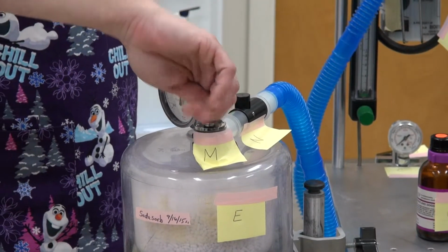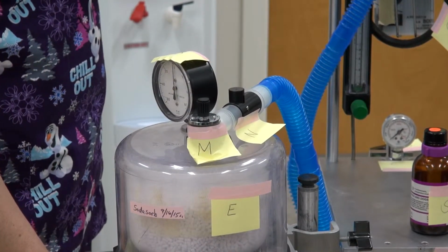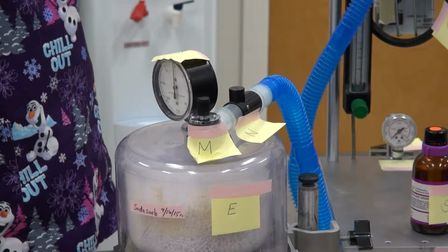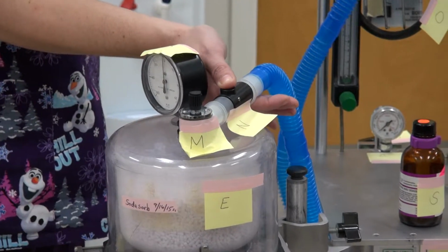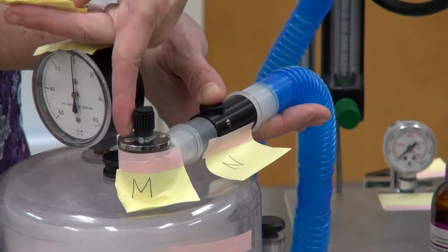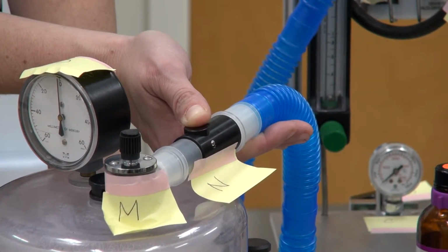Correct. If we've accidentally kept this shut and our bag blew up and up and up, what's happening to our patient's lungs? They're inflating. So what can I do in that emergency situation? You're going to hit the emergency switch right here, and that is going to bypass your pop-off and allow it to escape your bag, right?